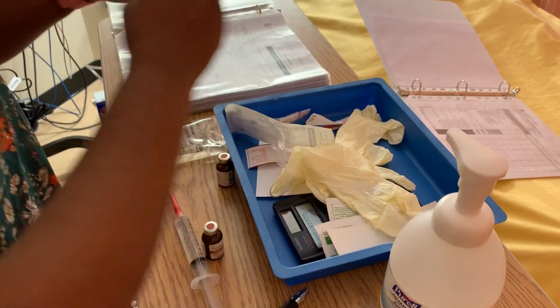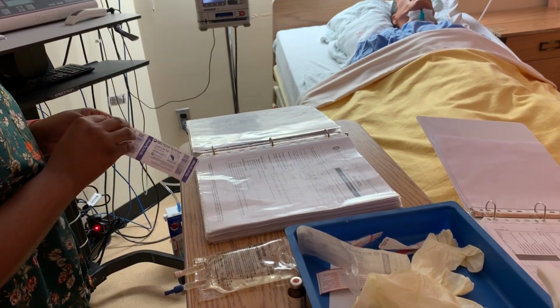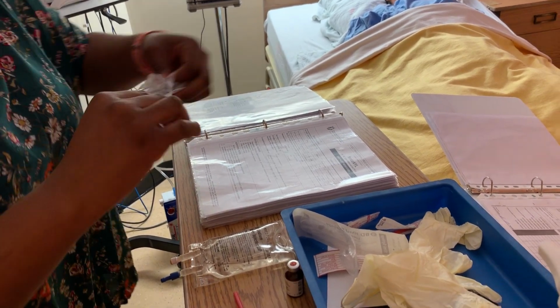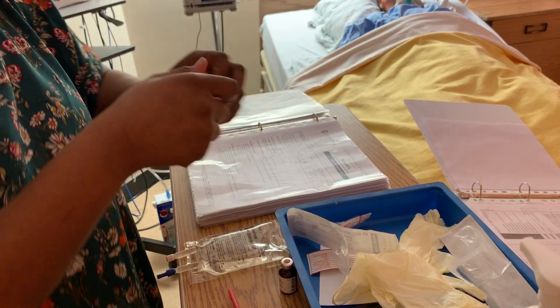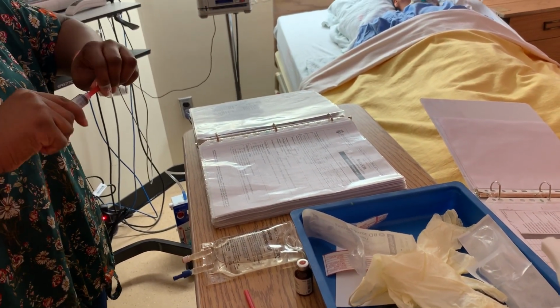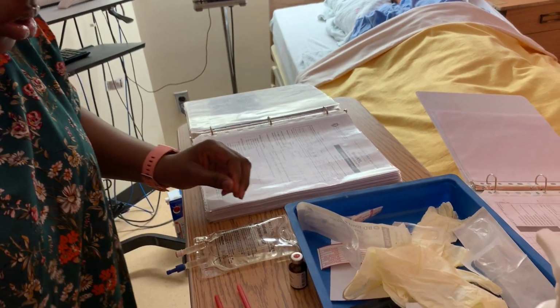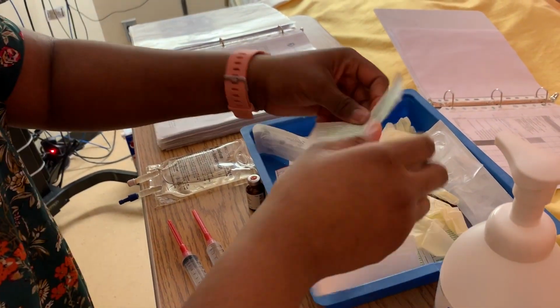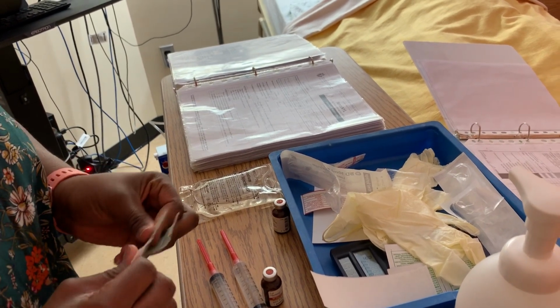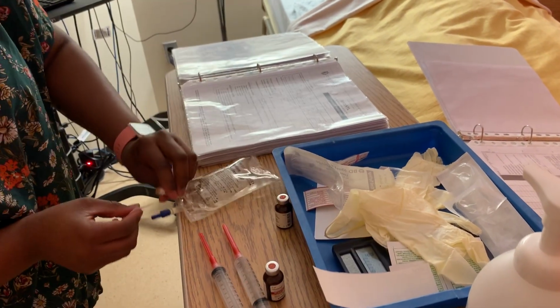So again, I'm just gonna get another syringe. I have hung it on the hook. Check the right tubing that is all fine from the previous one. So I'm gonna first alcohol swab this. The filter is fully full.